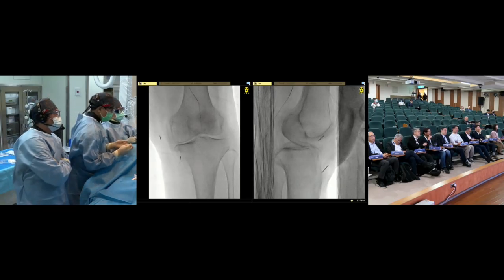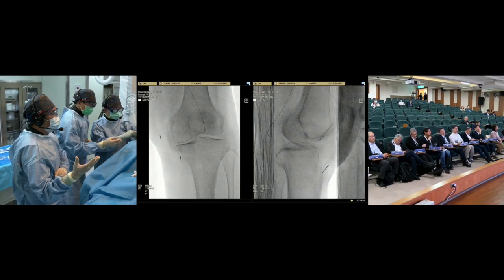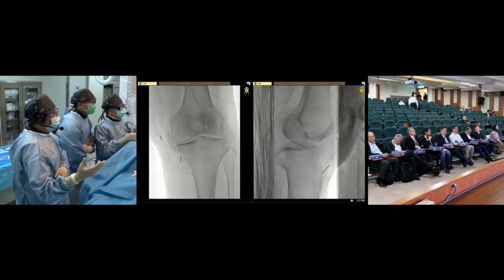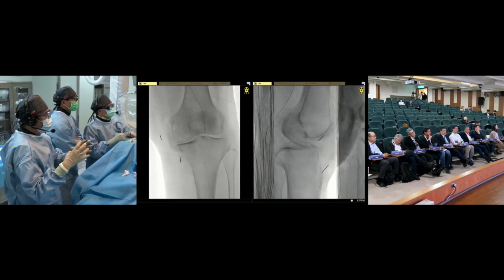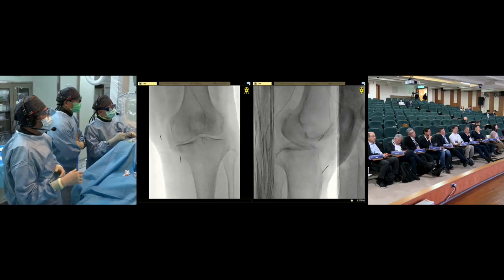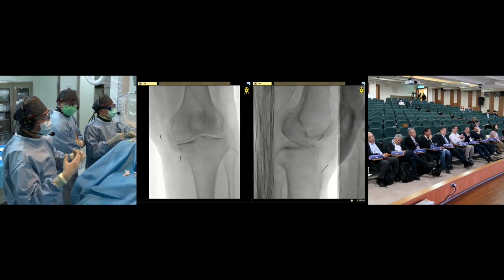And Dr. Zhu is trying to engage the lateral branch. Although she complained about medial knee joint pain, sometimes the lateral one, for example the lateral inferior genicular artery, will go to the anterior knee joint area, the infrapatellar area. So it's just like a wave around the knee, a genicular arterial wave. So if you use transient embolic agent, Dr. Okuno and faculty from other countries suggest engaging every genicular artery. It will bring better results.